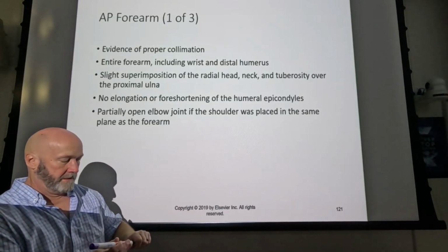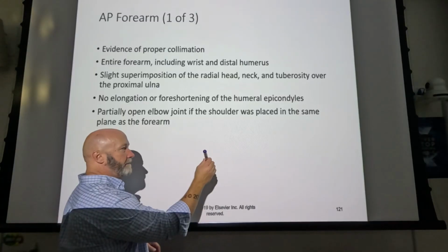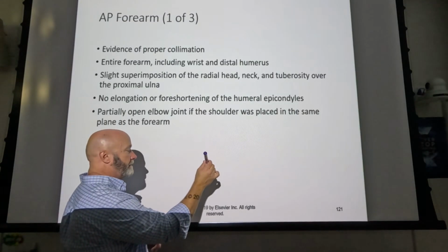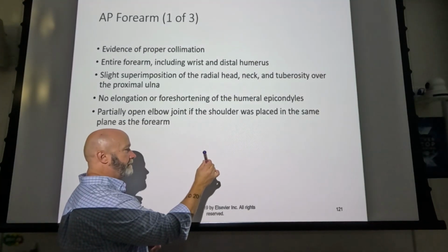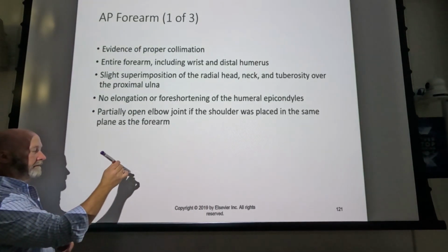All right. So if I have this right in the middle of my light field, what shape is it? Circular, right. Now I want to try to do this without moving the orientation of this. As I go out this way, what happens?